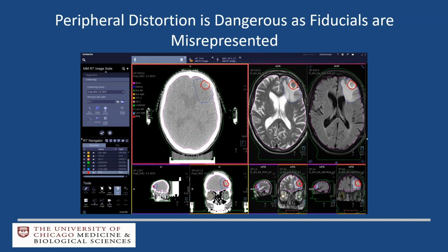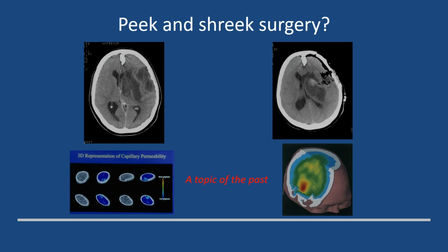We took the same field of view, segmented the volume, and then without transforming or fusing the MR to the CT, just put them on the different scans. And you can see on the right on the MR, you're clearly within the parenchyma, whereas actually on the CT scan, which is the precise orthogonal image, you are already in the bone, which makes a difference if we are aiming at peripheral targets.